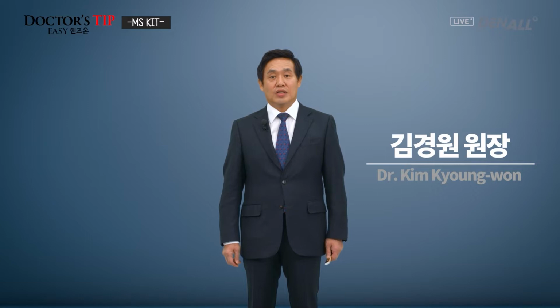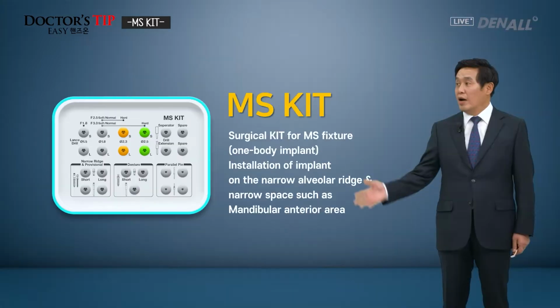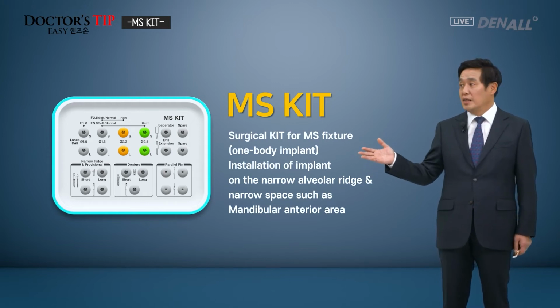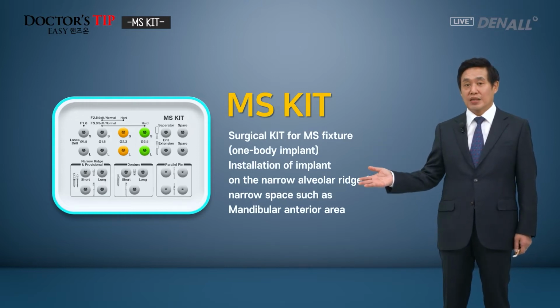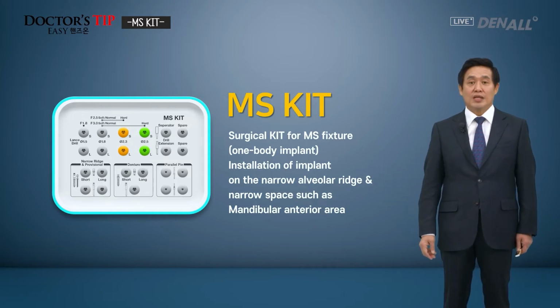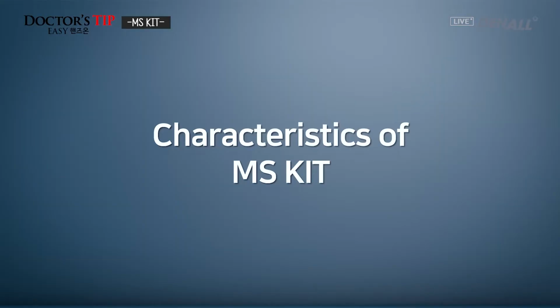Kim Kyung-won. Today, I'm going to talk about MS Kit. MS Kit is for the mandibular anterior side, narrow ridge, and if there is a small space, then you use the MS fixture, the narrow implant from Osstem. And it's a one body implant, and this is for such purpose.